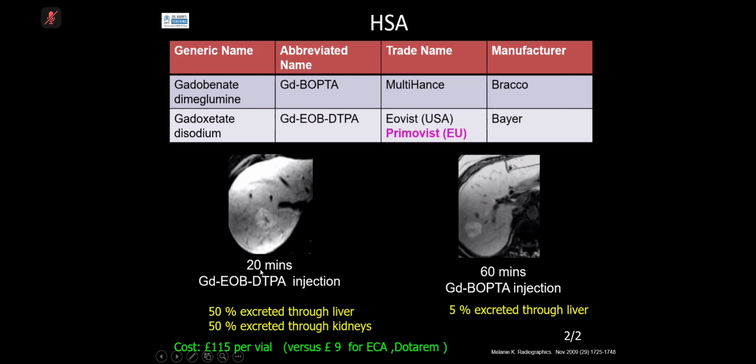And so whenever there are normal hepatic cells, it will be either isointense or hyperintense. FNH by definition is not a neoplasia. It is a vascular malformation, and it means it is a hyperplastic response to vascular malformation. So that will have normal hepatocytes.